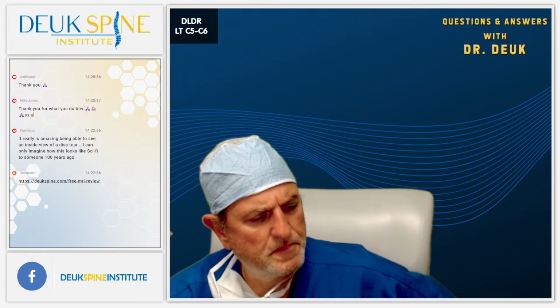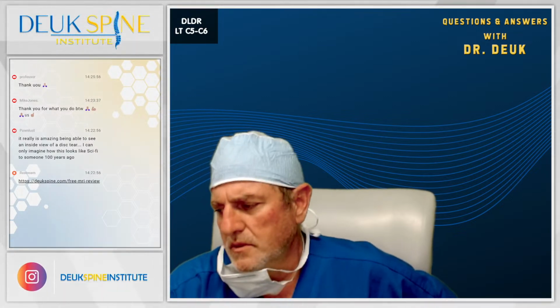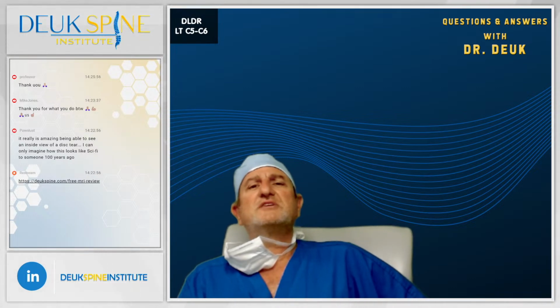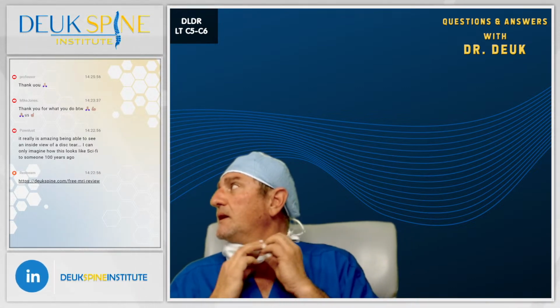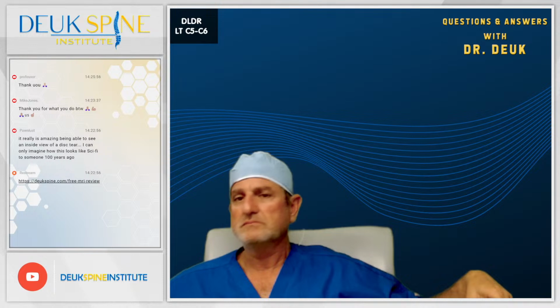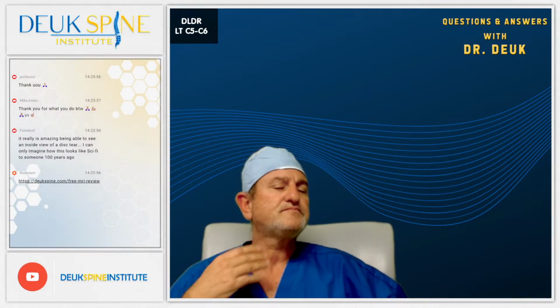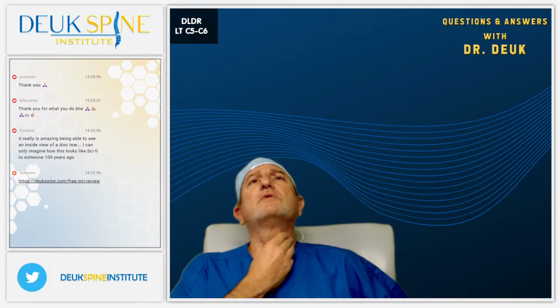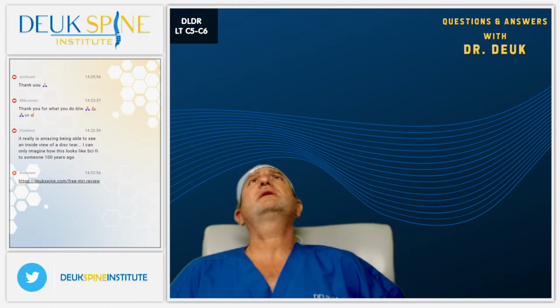Next question coming from Faisal, once more on Facebook, asking, Doctor, how far are the discs in the neck? How deep are the discs? Thank you. Faisal, great question. Obviously, you guys are watching me do surgery, and can you see my neck? On the camera? All right. So our patients are laying like this, looking up at the sky.